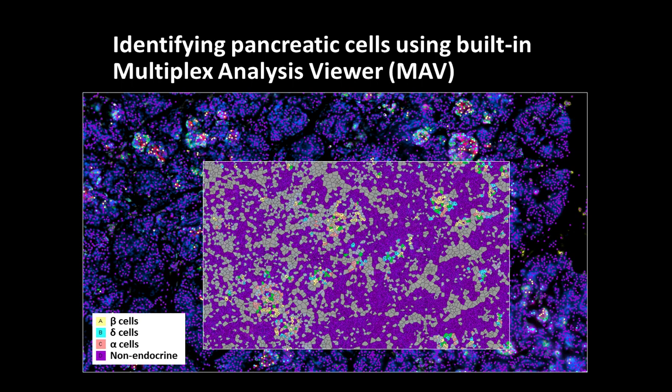And then this is a Voronoi plot, actually just an overlay here of the image, but you really get the sense of how intricate it is and at what high resolution we're going to be able to map these specific cell types. Some of the things that we're going to do in the future will involve applying the multi-marker analysis tools that Dr. Carlson mentioned before in order to answer some of the questions that we are asking about the interactions between cell types in the pancreas.